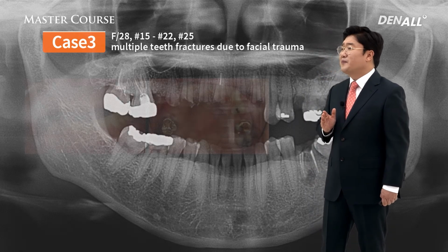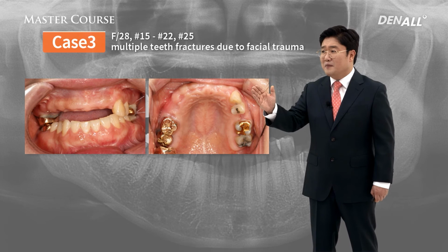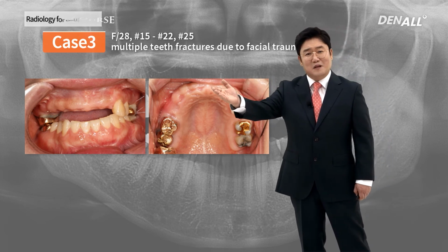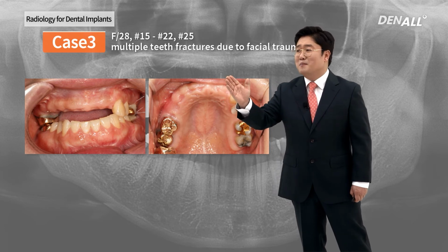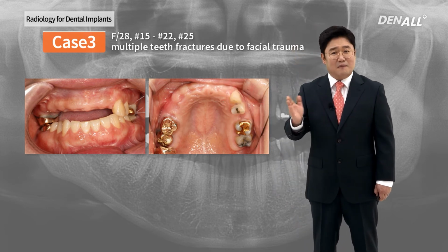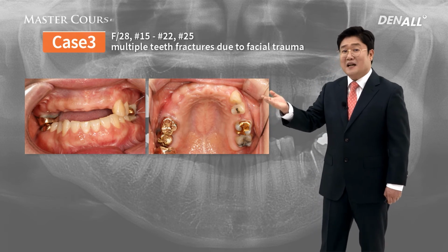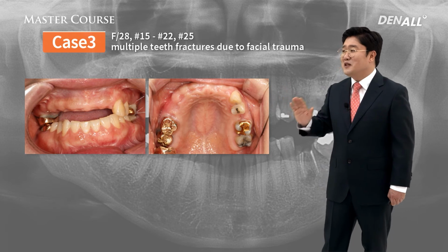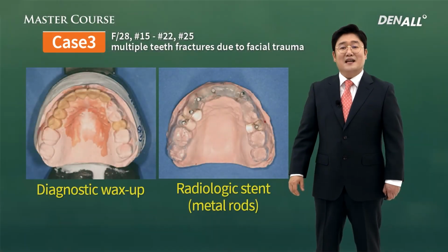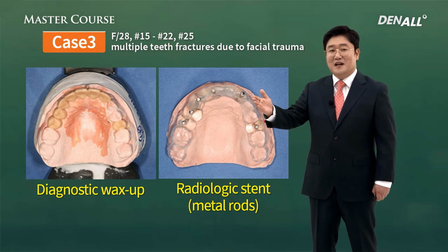Therefore, what we did was, this is pre-op. See how terrible it is. The trauma is very terrible. This is a young patient. All front teeth are destroyed. She must have suffered tremendously. The maxilla is edentulous. Extraction was done first, and this is healed after that. The casts are made like this.